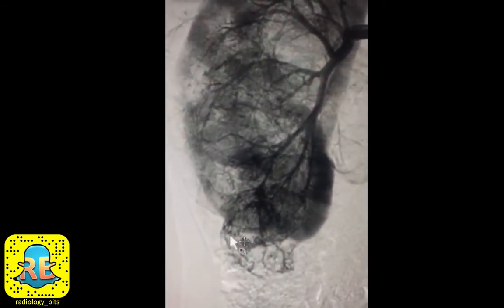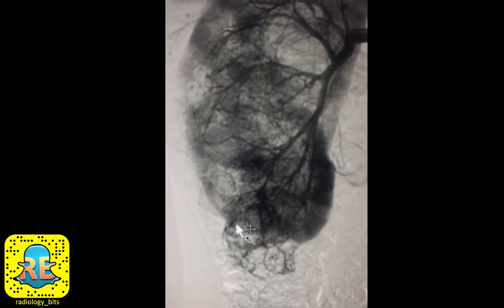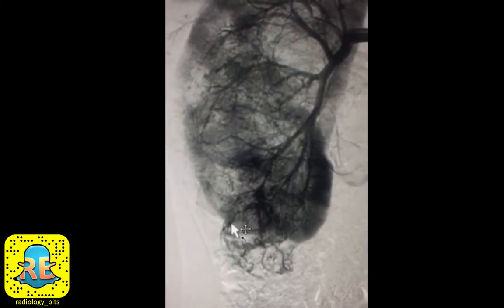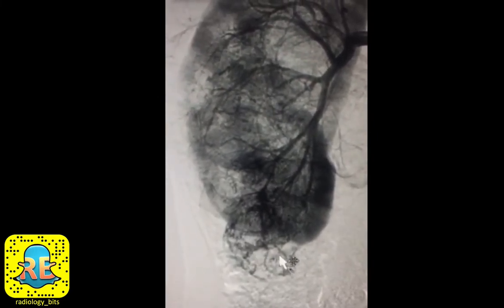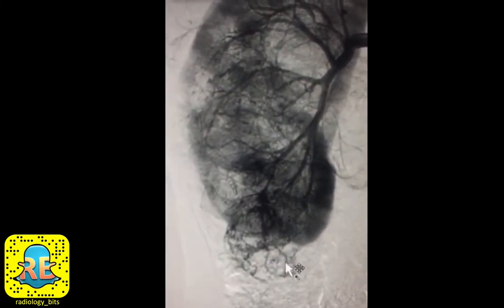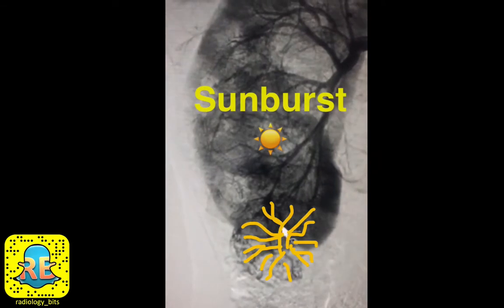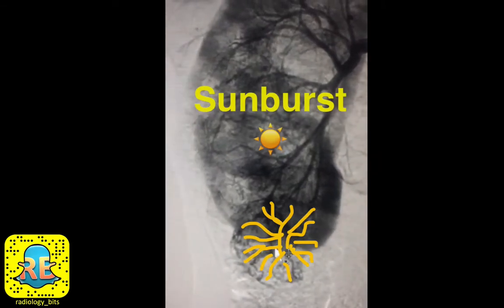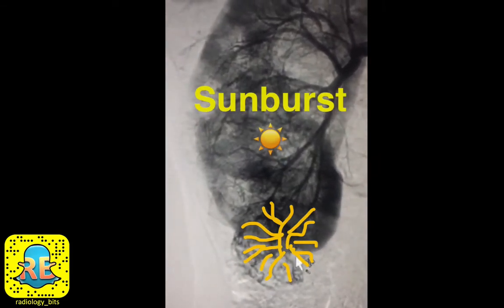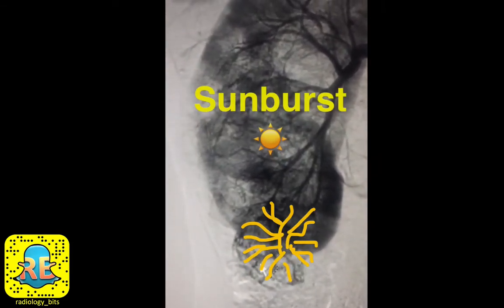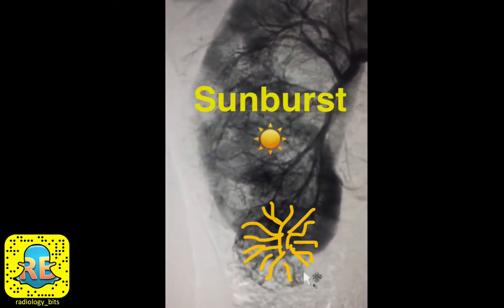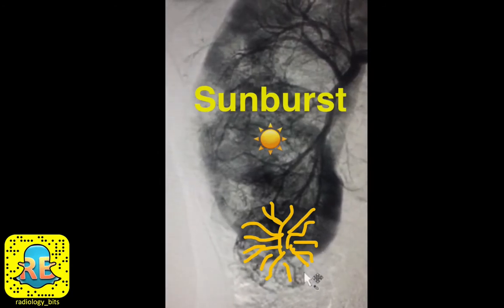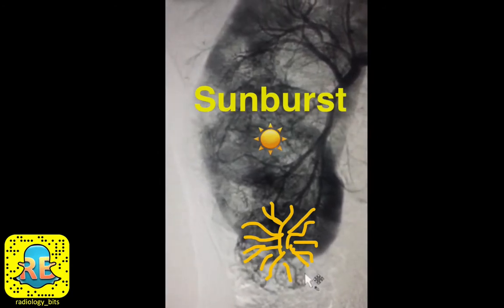Again, this highly vascularized region shows tiny dots representing pseudo-aneurysms. This abnormal appearance of vessels radiating outwards in a focal area is known as a sunburst appearance.